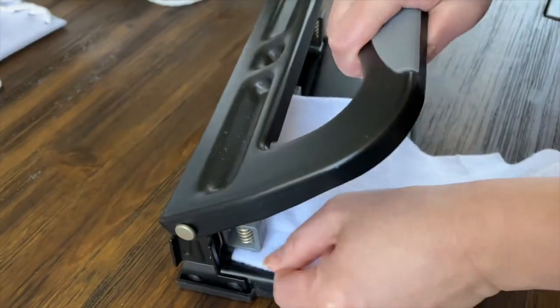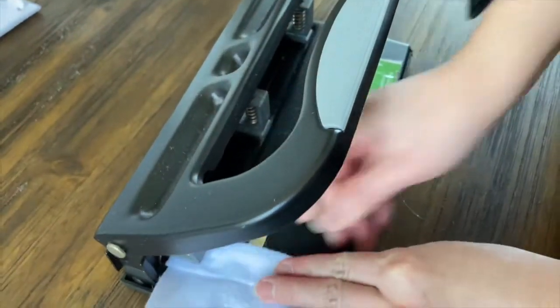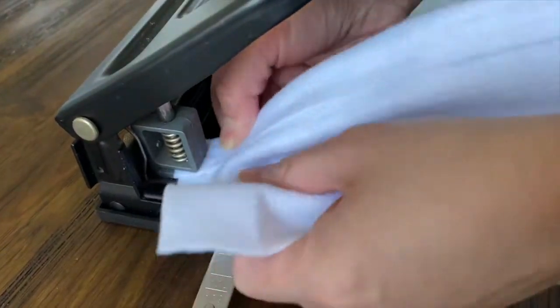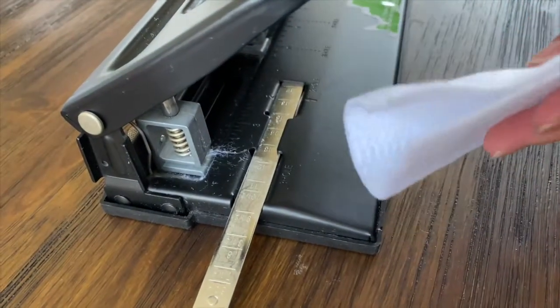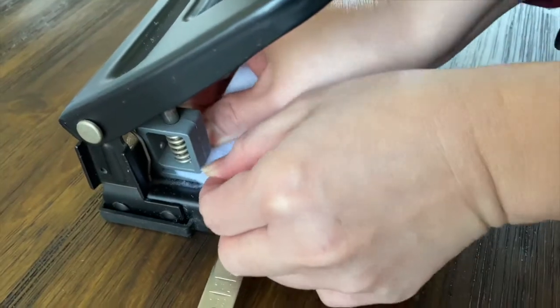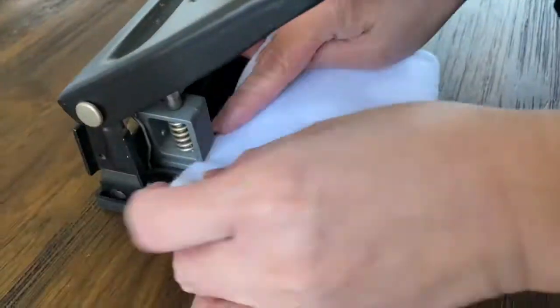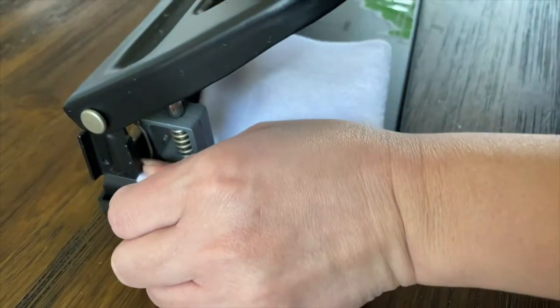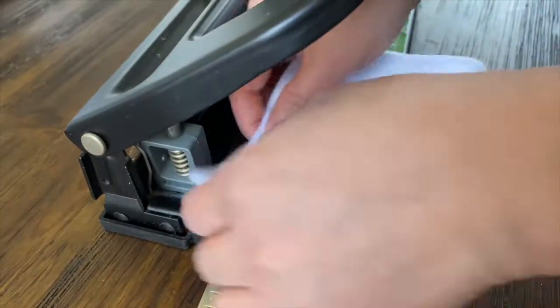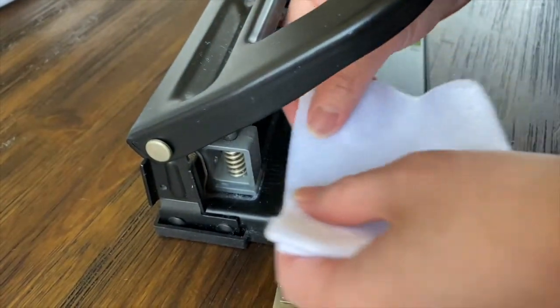So the next step is to punch holes in all of the sides of the fabric. So what you're going to do is start with the thick ends at the top and punch holes through those first at both corners. And the next thing you're going to do is fold it so that it's easier to do all sides, and then cut off of the corners. Next, you are going to punch holes about 1 inch apart from each other on all sides of the piece of fabric so that the string can be strung through them and it can pull.